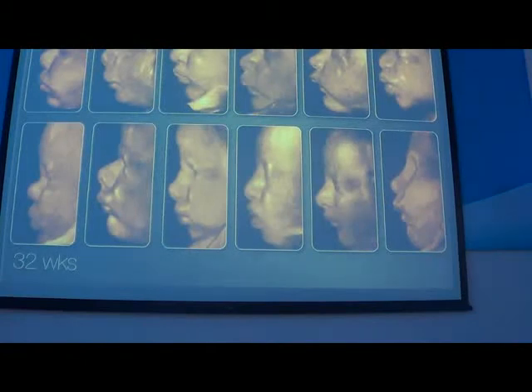And especially when it's possible to do it, with this profile view at 32 weeks, you can see that all the babies are different.